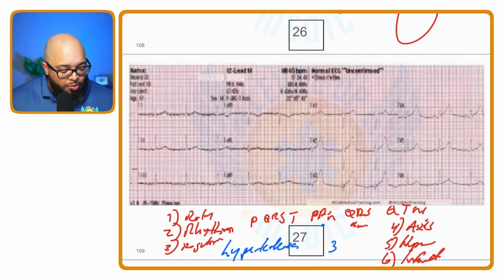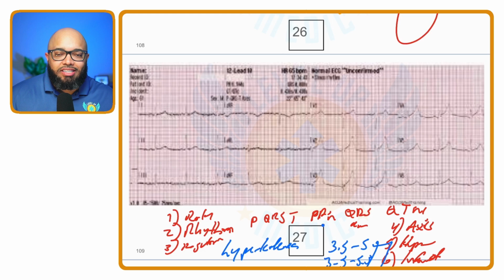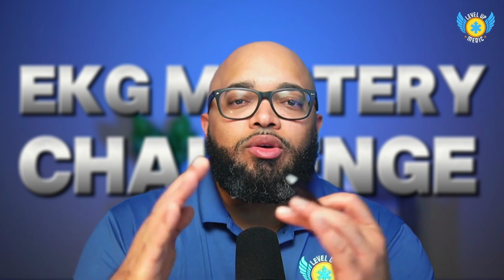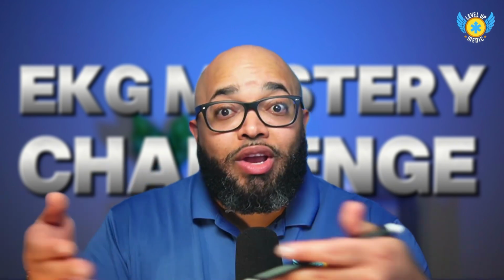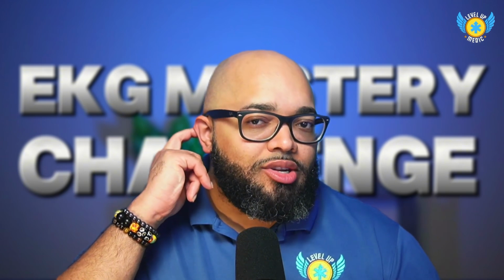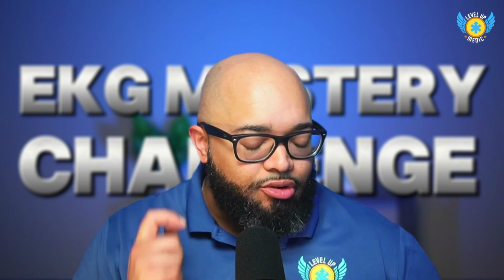Well, remember our normal potassium. Some books will say 3.5 to 5. Other books will say 3.5 to 5.5. But either way, greater than 5.5 is going to be evidence of hyperkalemia. What we notice in hyperkalemia, for instance, now you don't always see this, it depends on the timing. So it depends on when you're catching them and their potassium is elevated. And it also depends on how high the potassium level is.